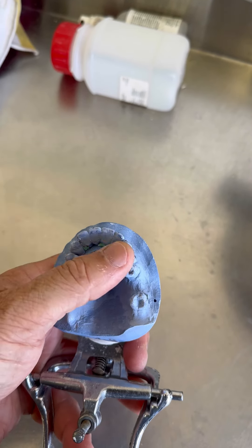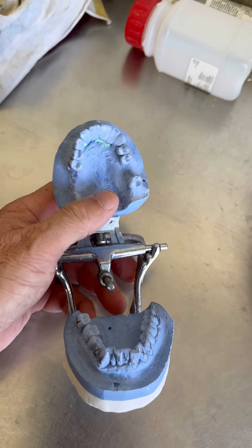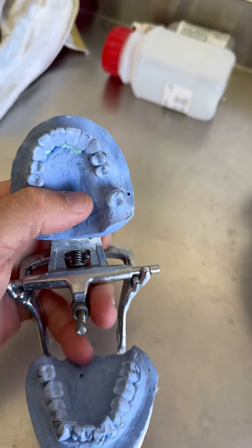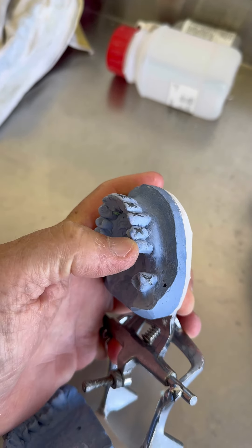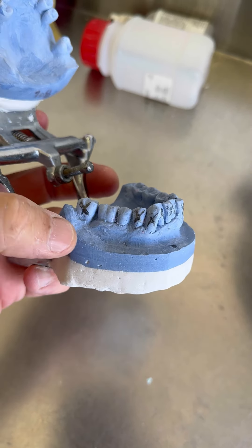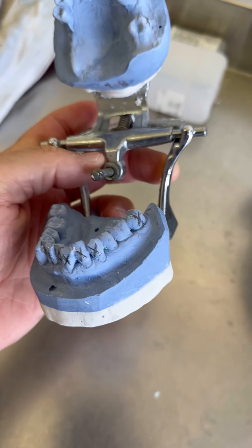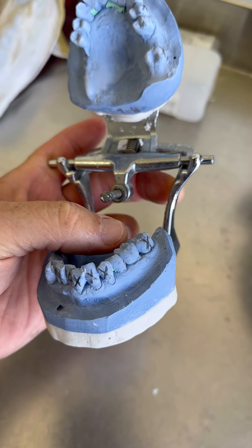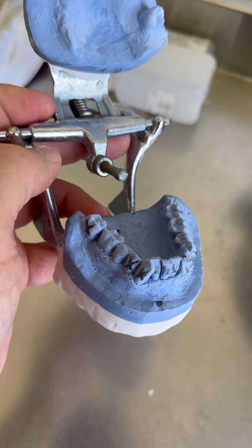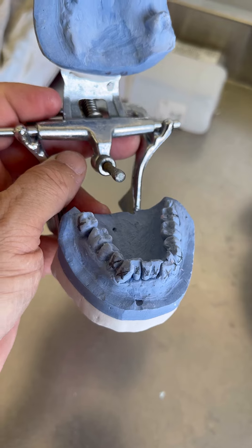А здесь верхний — стоял мост с металлокерамики, но он уже отслужил своё. Оставляется у нас тут только тройка-четвёрка сверху. С этой стороны у нас остаётся пятёрка. Нижняя челюсть: остаётся пятёрочка-шестёрочка с этой стороны и с противоположной. На остальных всех зубках стоит крест. Значит, будем их удалять, вырезать. Покажу, как это будет выглядеть.